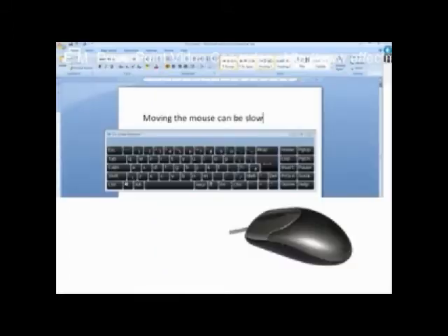I was diagnosed with motor neuron disease in 2007. By the end of 2009, my speech had deteriorated significantly, although most people could still understand me. Using a computer keyboard had become so difficult I was using a mouse with an on-screen keyboard, which was very slow.